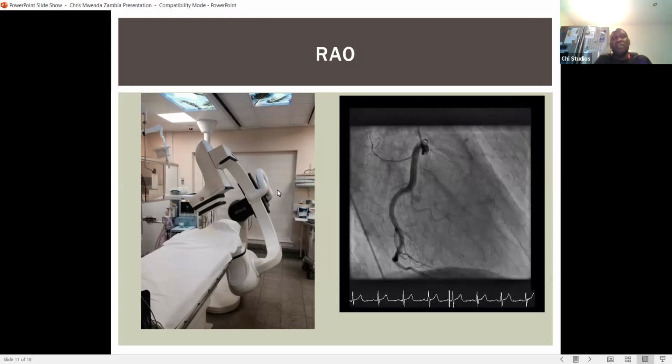You can see this is the shield we use for the doctors when they're working. Obviously, it's for radiation protection. And if you see there, obviously, this is just part of cosmetic. One of our patients here at Wigging Show is the one who donated the money so that he can create an environment whereby the patient, when he's having a procedure, feels secure or feels at ease.